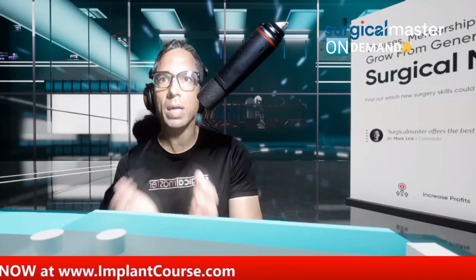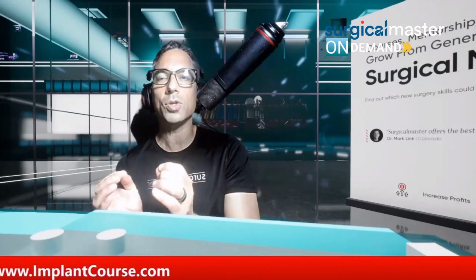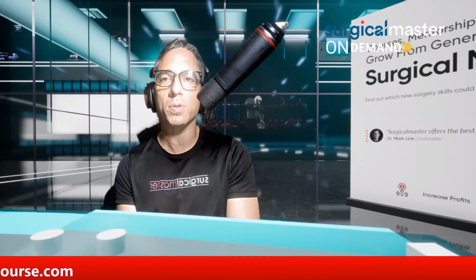So clear. So why is that an issue? You drill to the sinus floor with the narrowest drill, a twist drill, 2 millimeters. Then you take another drill that is, let's say, 3 millimeters, depending on your implant system. Then the next drill is 4 millimeters. That's how you create it. That's it. I'm sorry, I didn't think there was more explanation needed for that.